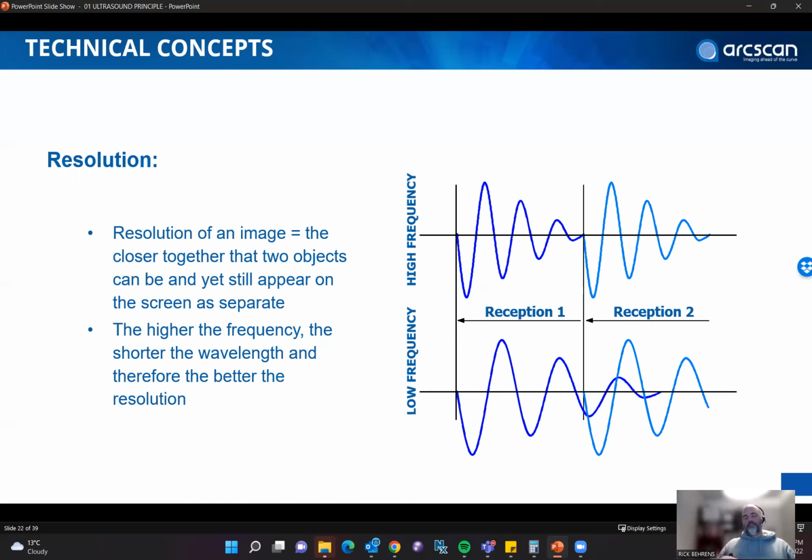In the case of our device, we are working with a really good resolution in the anterior surface. There are claims that we can detect up to 1 micron change in the epithelium, and 50 megahertz will produce a resolution of around 30 to 35 micron structure.